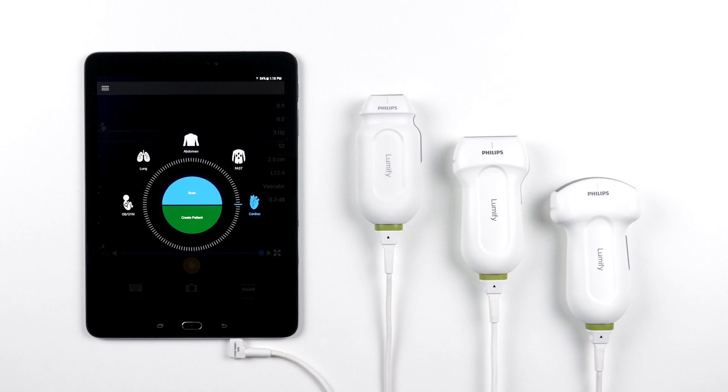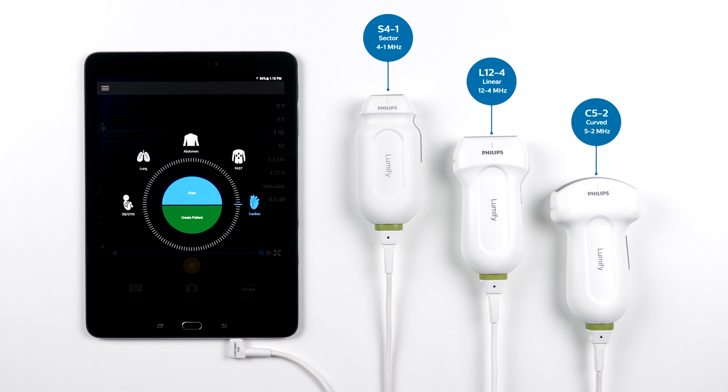To start, let's review how the transducers are named. The letter at the beginning of the name tells you the type of transducer it is, and the numbers tell you the frequency range it uses. So the S4-1 is a sector transducer and the frequency range is 4-1 MHz. The L12-4 is a linear transducer and the frequency range is 12-4 MHz. The C5-2 is a curved array transducer and the frequency range is 5-2 MHz.